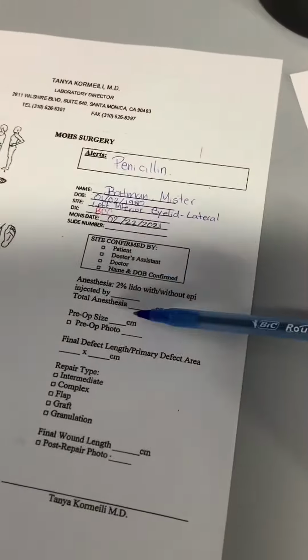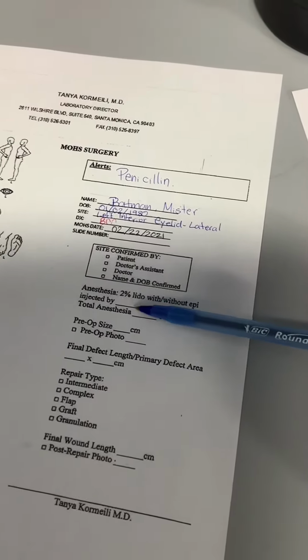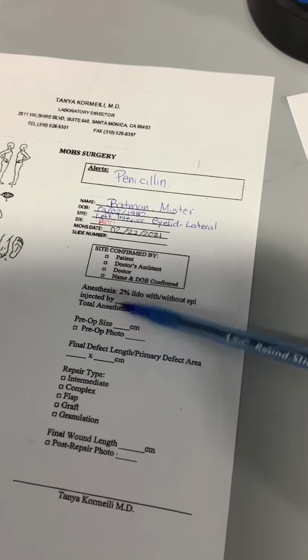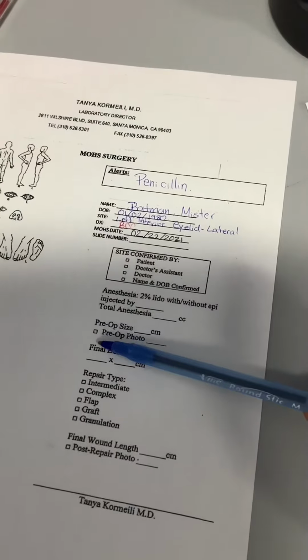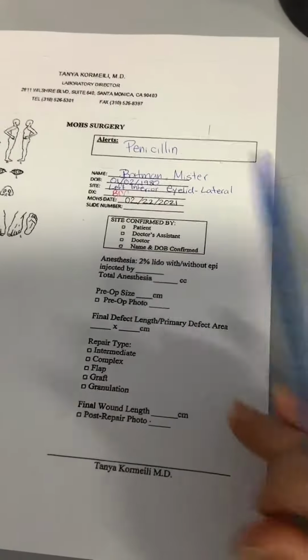As the surgery proceeds, this area gets filled in by how much anesthesia and who injected. So it's either Dr. Kormeili, Dr. Sandifar, and what we started out with. So the initial drawing would be like, let's say 5 millimeter, and then the pre-op photos, if you did that, you check that off and your initials.